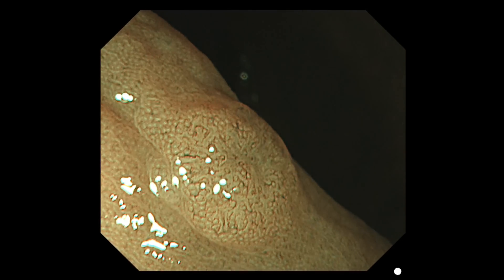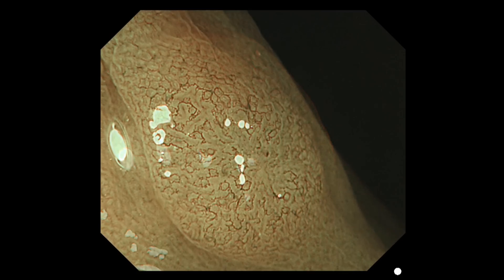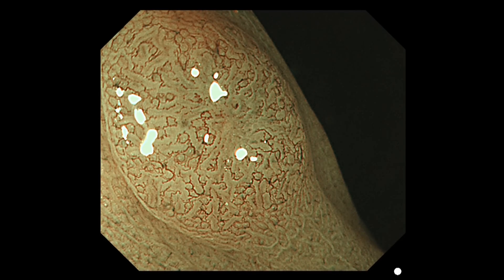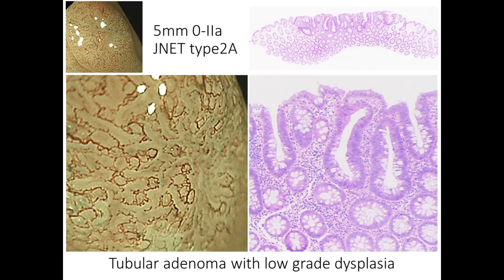This slightly elevated polyp, 5 mm in diameter, has a shallow central depression, also called valley sign. We don't classify this as a depressed Type 2c because the depression has a wavy patterned edge and doesn't fall sharply. By zooming in on this lesion, well-ordered reticular or spiral vessels with a regular surface pattern can be observed in the large portion of the polyp, so it is classified as J-Net Type 2A. Endoscopists should not confuse the unclear vessel appearance at the central depression with J-Net Type 2B or 3. This polyp was resected by cold-snare polypectomy, and the histological finding was tubular adenoma with low-grade dysplasia.